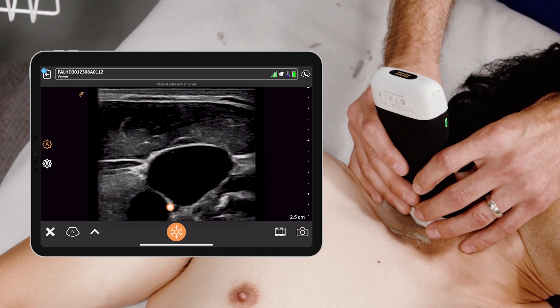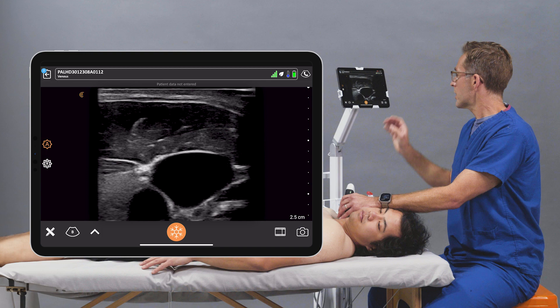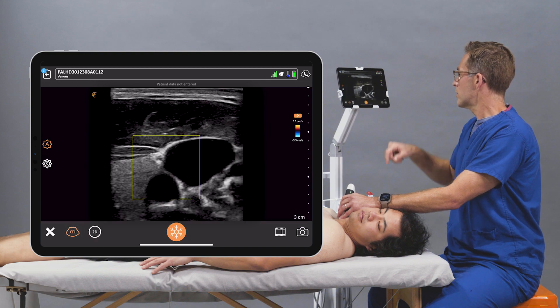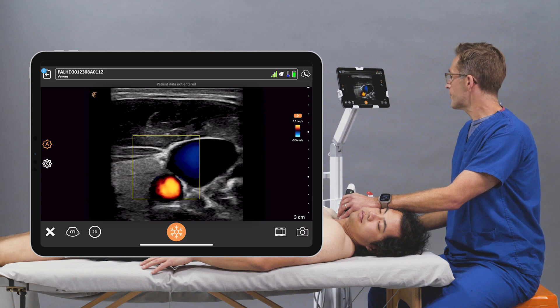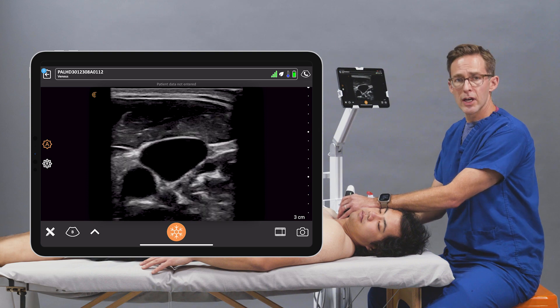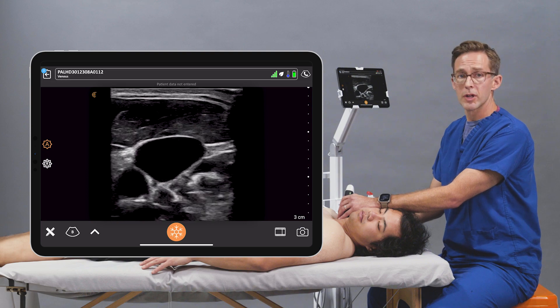The carotid artery sits deeper and more medial. It also has a thicker walled membrane. And when you put color flow, you see that it's pulsatile, and that's the carotid artery. Go back to 2D. Ultrasound can help with the accuracy of identifying the internal jugular vein and help minimize complications.